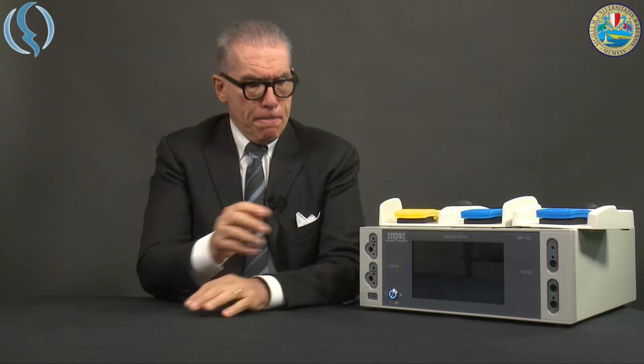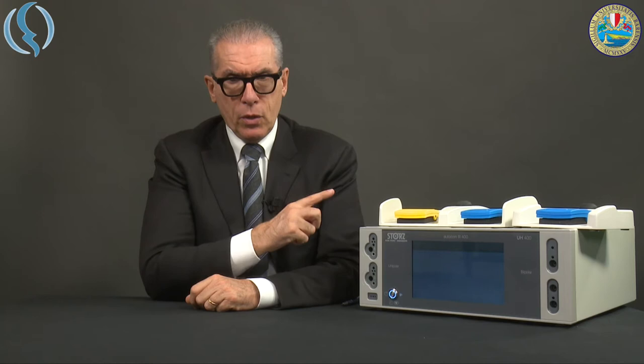Let's start now to work with the Autocon 3rd. First of all, we switch on the machine. Remember, this is only the standby button — the main electrical connector is on the rear side of the machine. It takes a few seconds. There is a nice startup sound introducing the company logo, and then the main screen appears. When everything is ready, we get all the lights around the connectors activated.